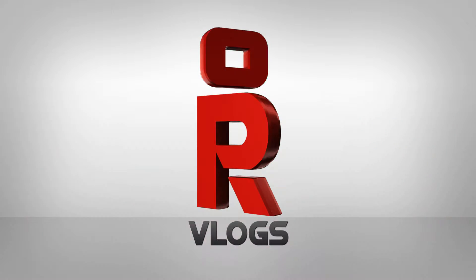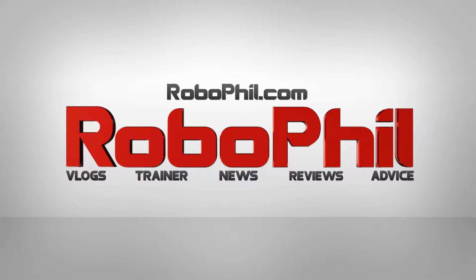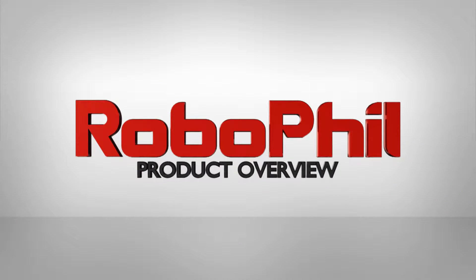Welcome. On this video we're doing a product review for the RIBA II robot, which has been co-developed by RIKEN and Tokai Rubber Industries. Hi guys, I'm Philip English from RoboPhil.com. On this video we're looking at the RIKEN and Tokai Rubber Industry design robot caregiving bot, RIBA II.